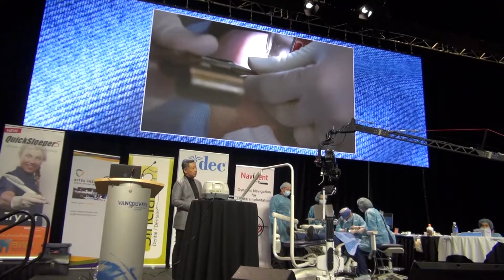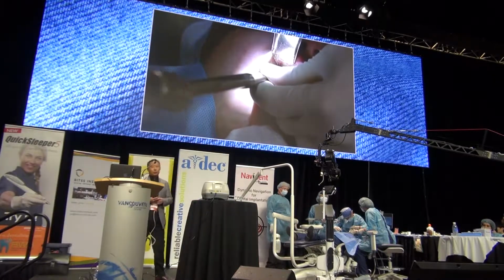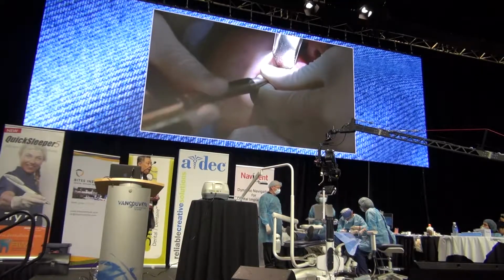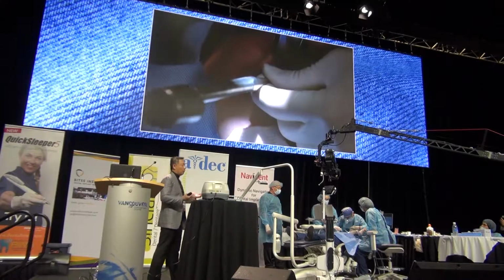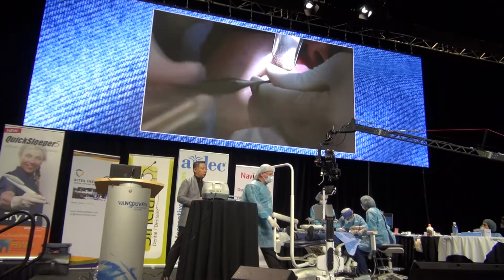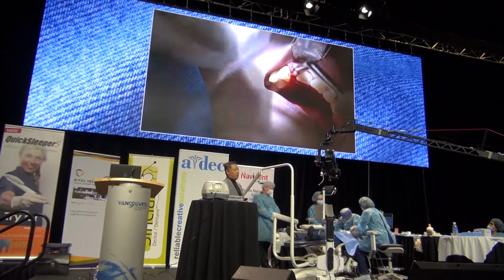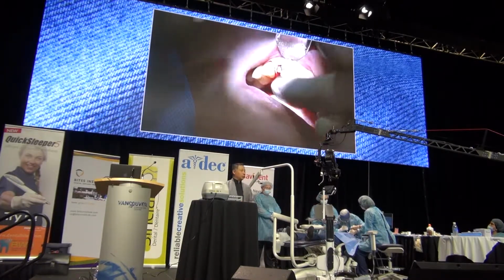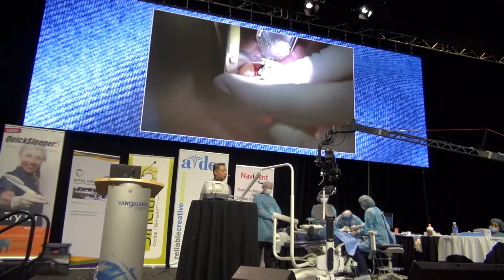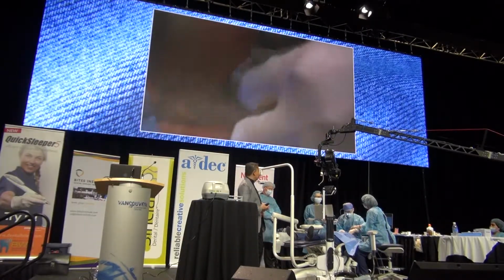So there are different protocols. We can use a chisel, we can use a periotome, and what we're trying to do here is to luxate and widen the periodontal ligament. The tooth root doesn't have to come out in one piece or multiple pieces, but again, just to get it out and preserve the buccal plate integrity and the hard and soft tissues. Once you widen the periodontal ligament, you can decide to cut and section the root and extract in multiple pieces. Looks like Dr. Kwan is going to get some beaks and it just pops out. Look at that. Good man.